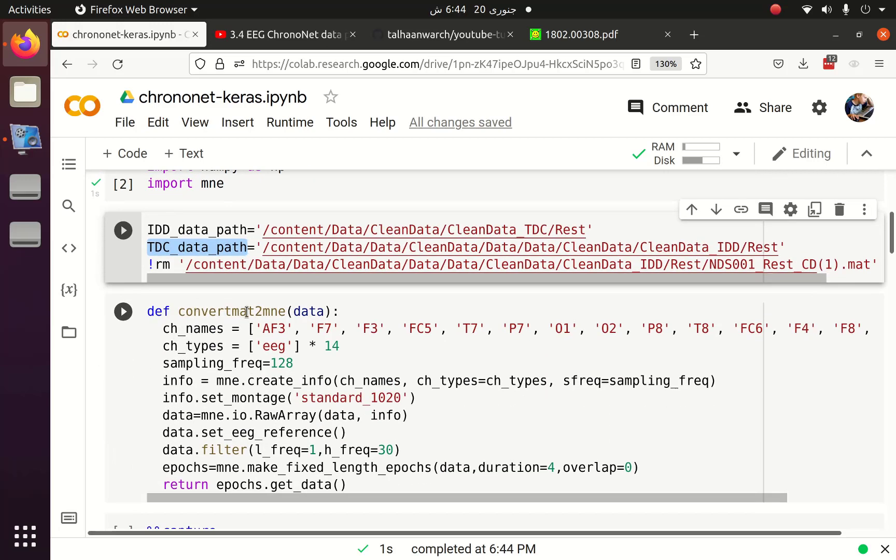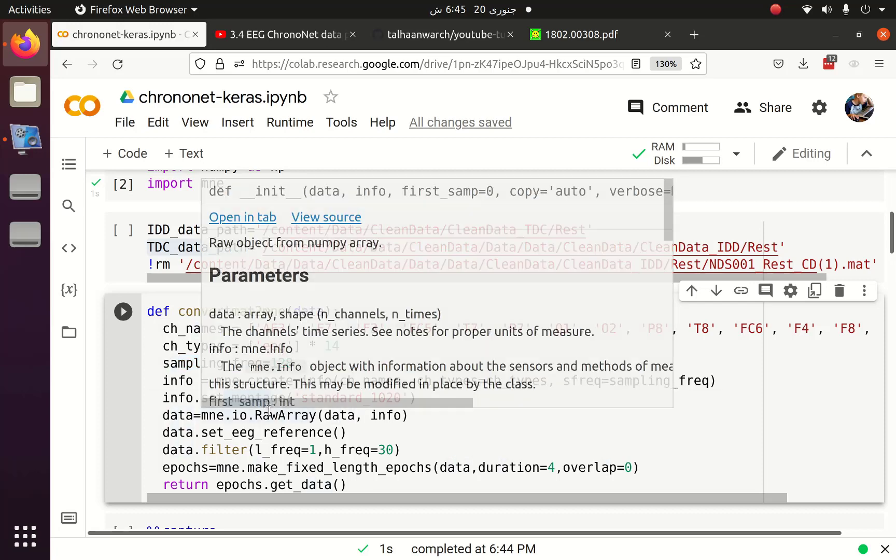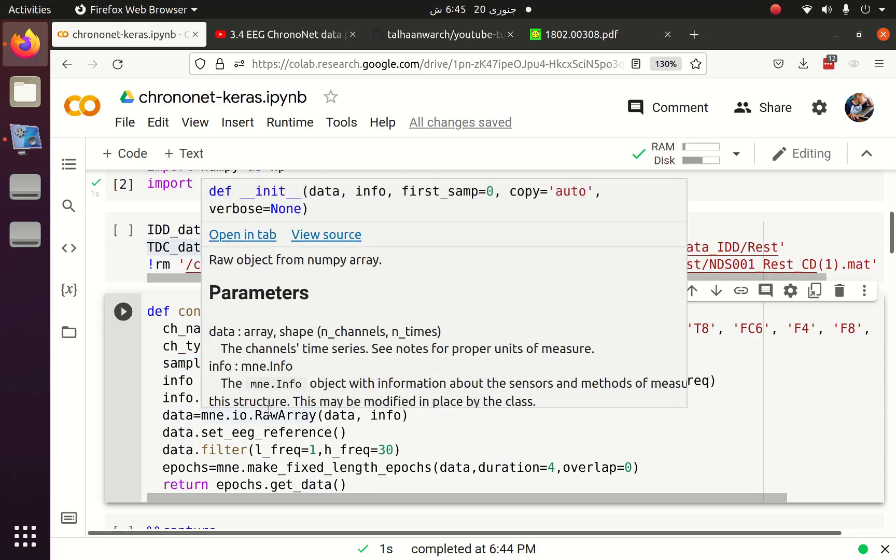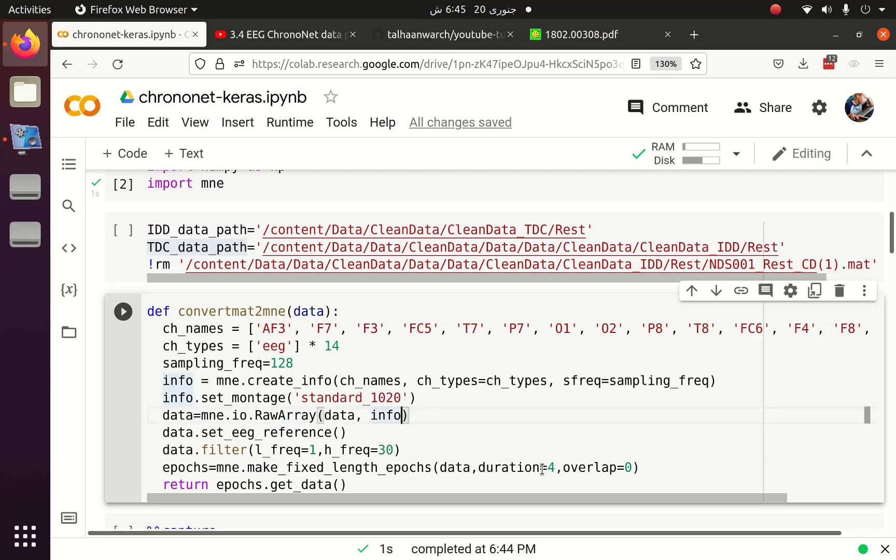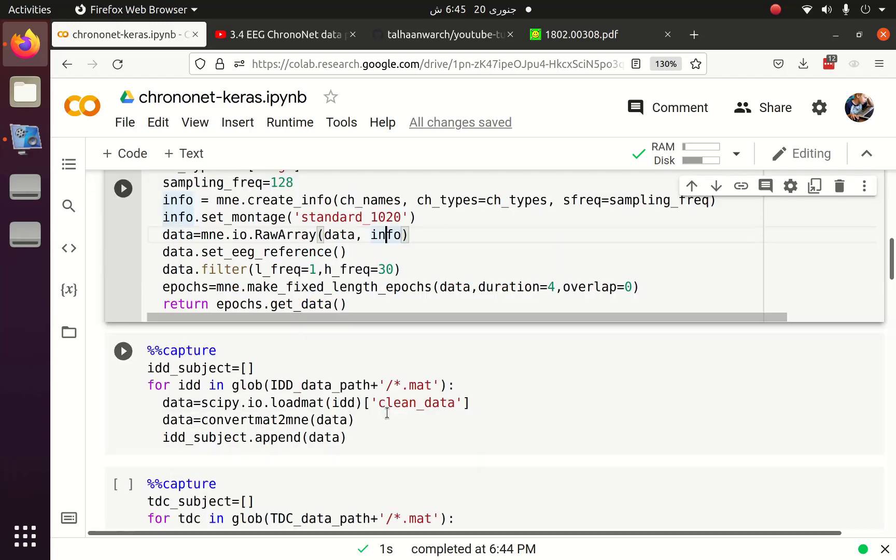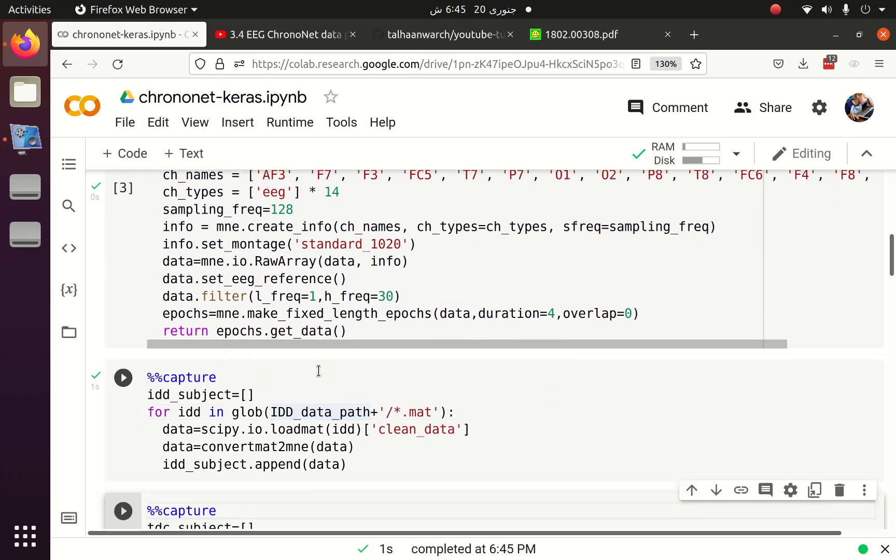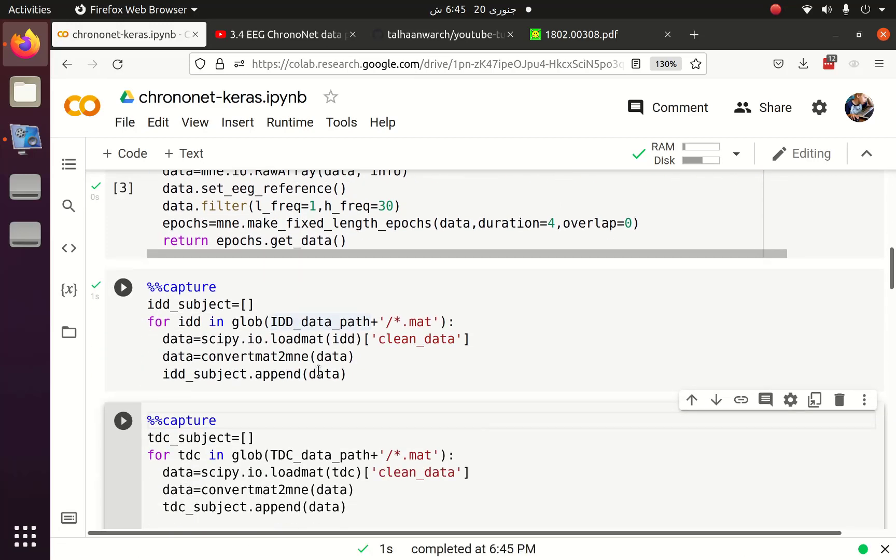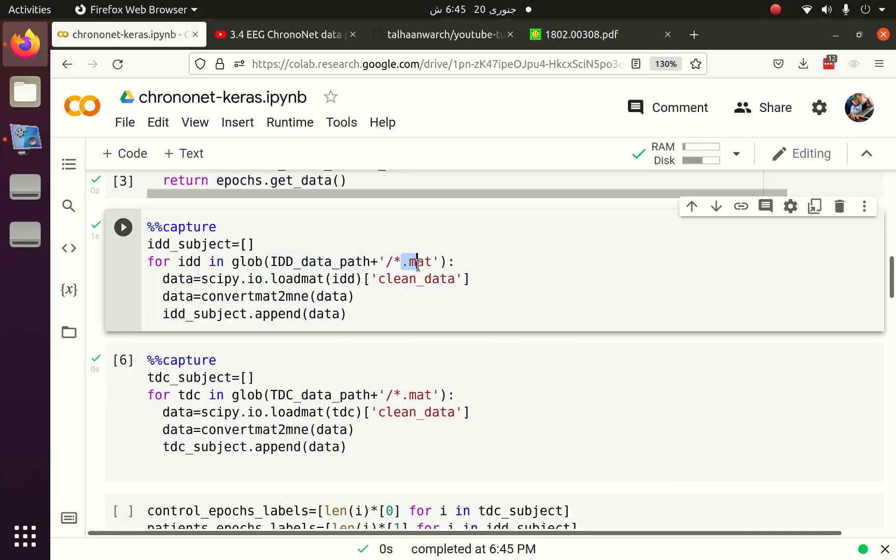After that we have to convert .mat file to MNE object. For that I need few things such as channel name, channel type and sampling frequency. I pass this to MNE create info, set montage and convert the data from NumPy array to raw array of MNE. Once the data is in MNE format I can set EEG reference, filter data and create the epochs of duration four seconds with no overlap.